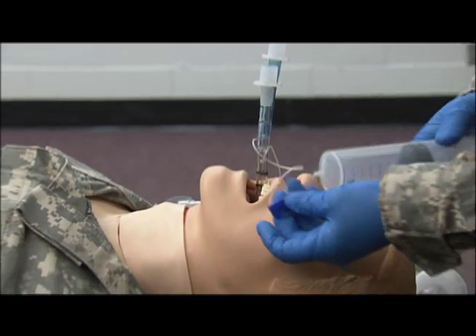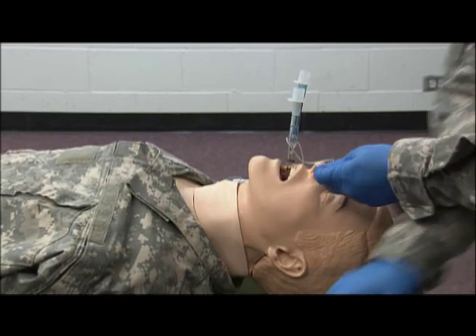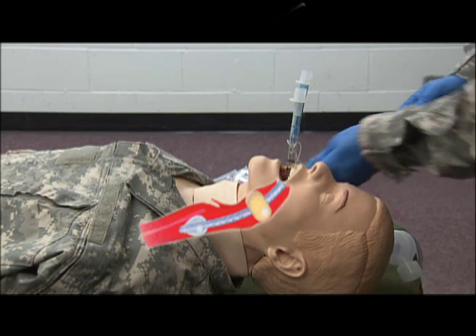Now, taking my large syringe and my blue adapter, I'm going to inflate the balloon. Then with the small syringe and the white adapter, I'm going to insert the small balloon.